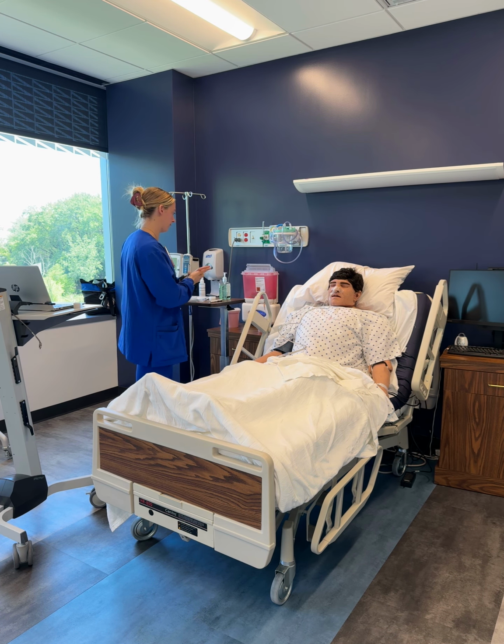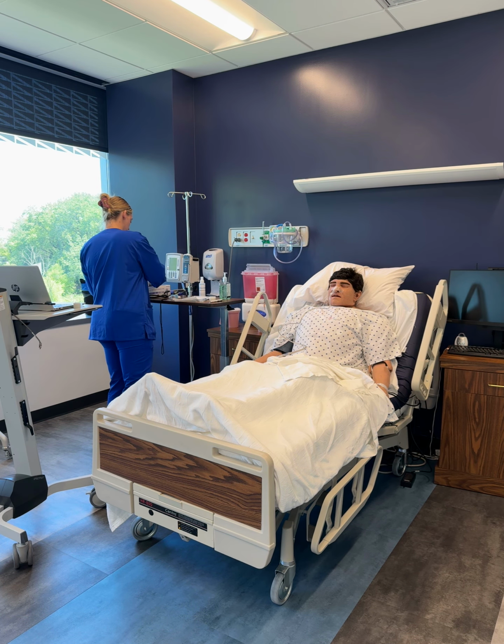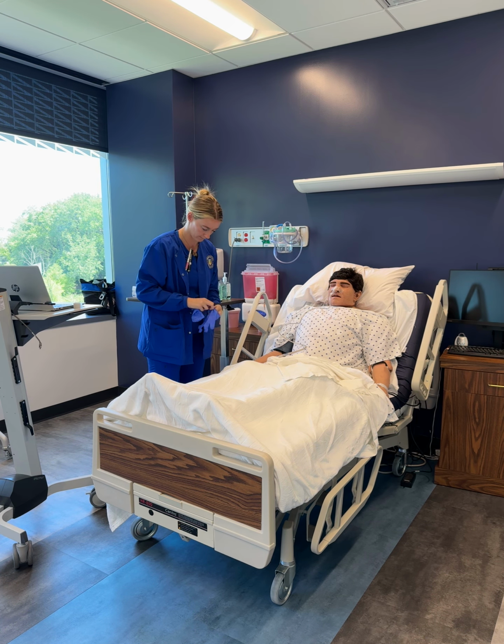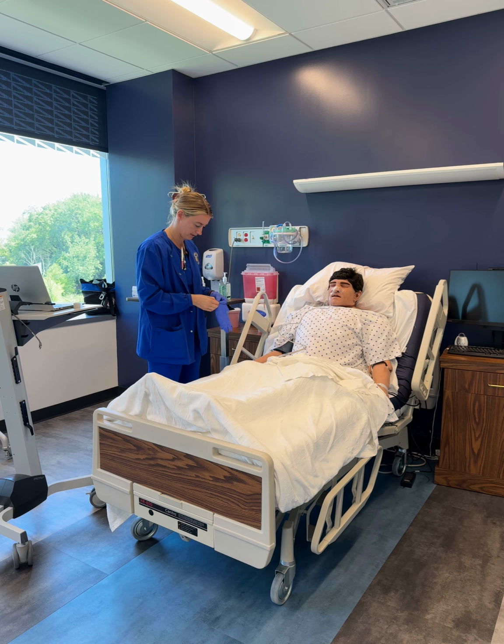At this time, I'm going to perform hand hygiene. I'm going to apply gloves. I'm going to then get my clean syringe.